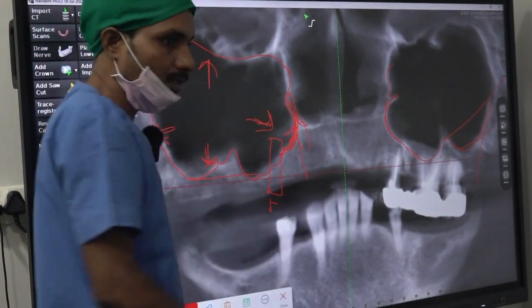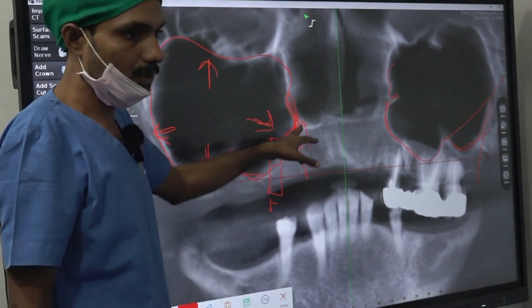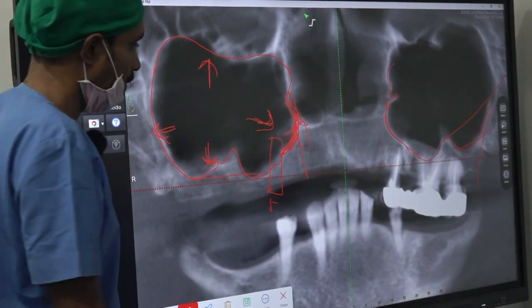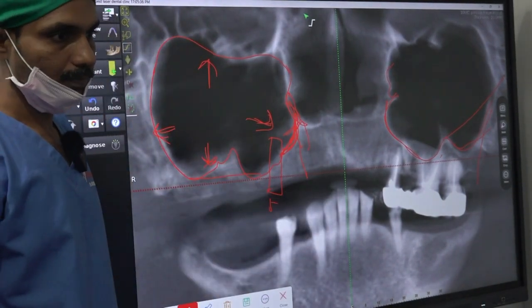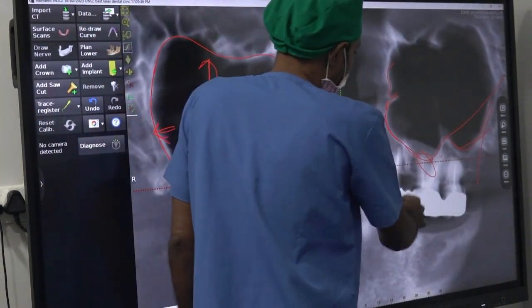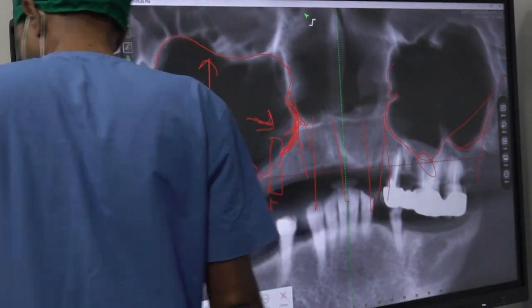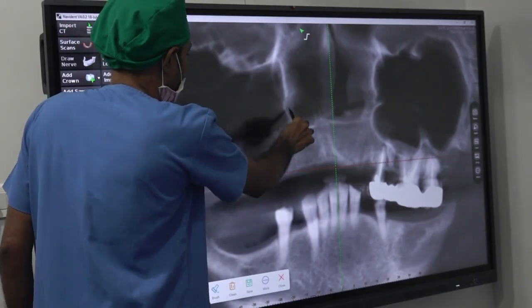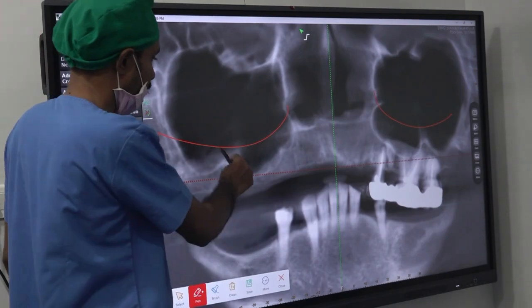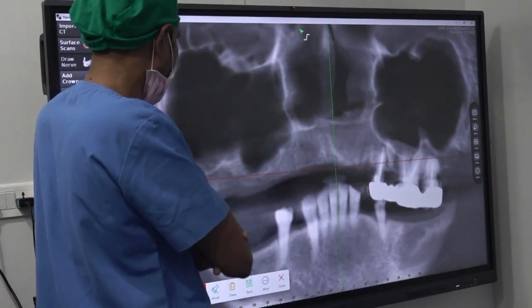Anterior extension: if a conventional implant surgeon is doing all-on-4, they will immediately see this anterior extension. This will tell whether they can do all-on-4 or need a zygoma or something. These are all classic cases which need zygoma, because you need some kind of support in between; otherwise only 2 implants, central and canine, we can place. So how to deal with this situation now? If the sinus is still here, then we can place good implants, whatever number of implants. But the situation is very tough, so we will plan this case.